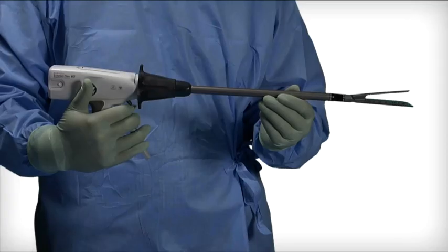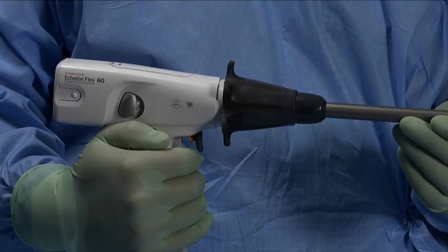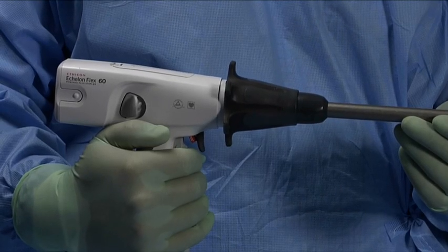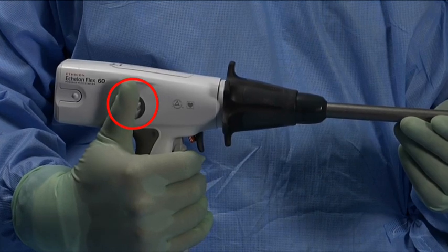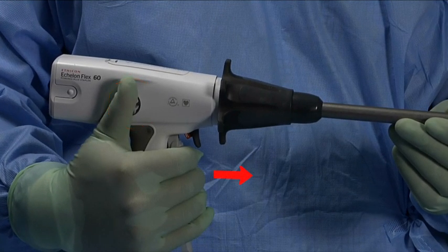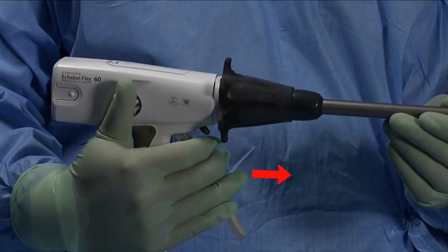Opening and Closing the Jaws. Close the jaws of the instrument by squeezing the closing trigger until a click is heard. The audible click indicates that the closing trigger and the jaws are locked. To open, squeeze the closing trigger while pushing the anvil release button located on the side of the device simultaneously, then maintain pressure on the anvil release button while slowly releasing the closing trigger.